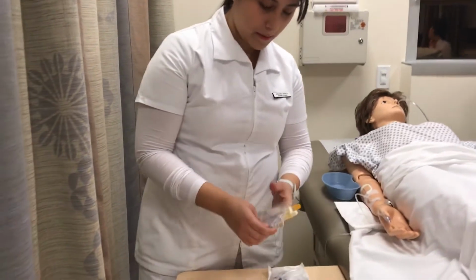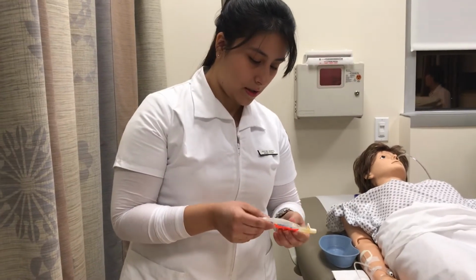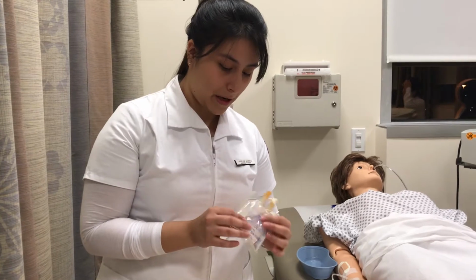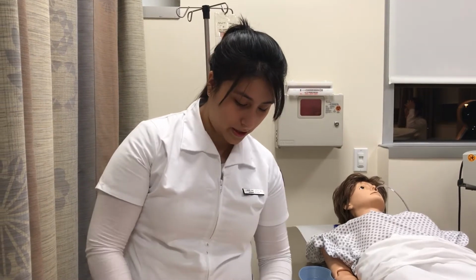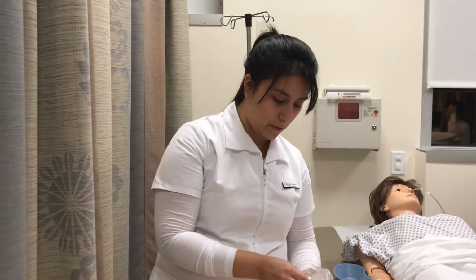So I'll be labeling, making sure that everything is okay with the bag, no punctures, no cloudiness, and I'll also be comparing with the MAR and labeling with date, time, and my initials. Same with the tubing. I'll be opening up my tubing.